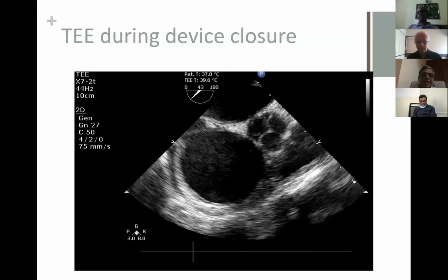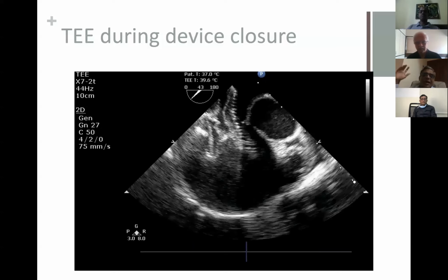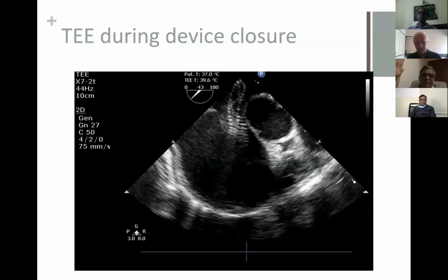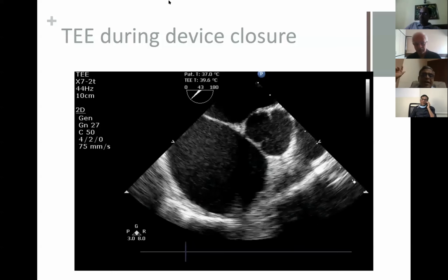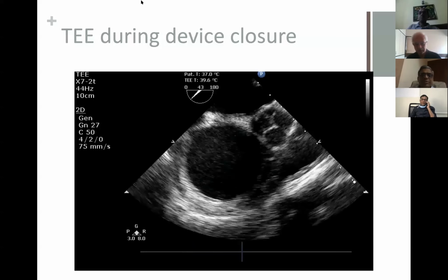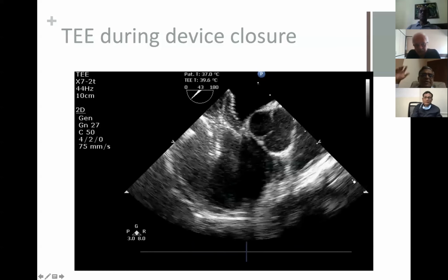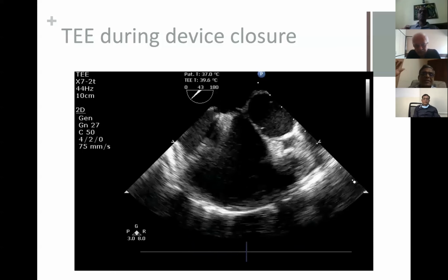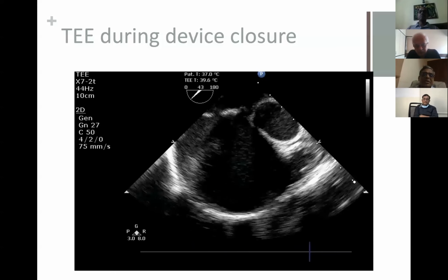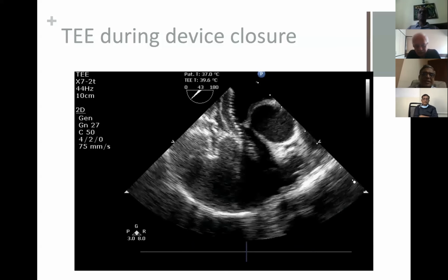I think the question is, we need to be honest about septal length. Most of us, I have stopped measuring it for a very long time, the last probably 1,000-plus ASDs. And we use other methods of making sure that we don't oversize the device. But the septal length as an entity is so vague and so non-standardized. I don't think it's worth wasting our time in actually getting that number and coming up with something arbitrary.